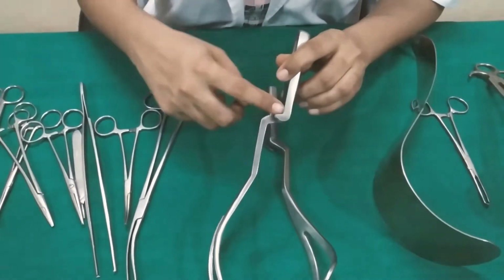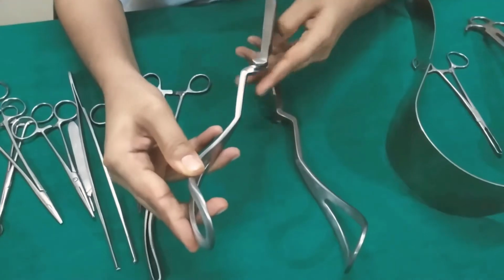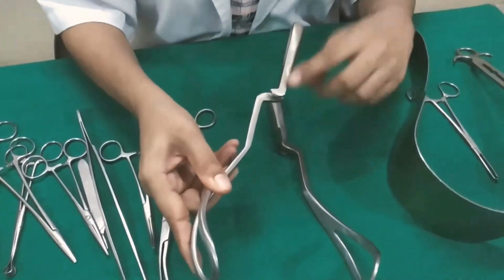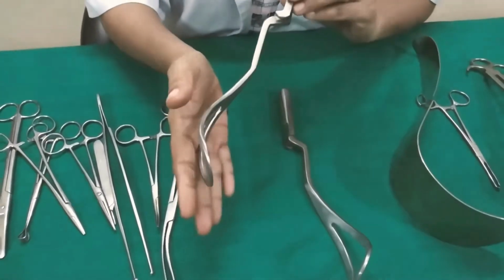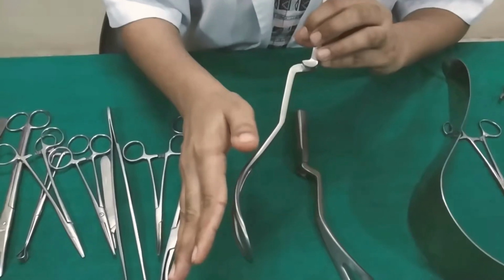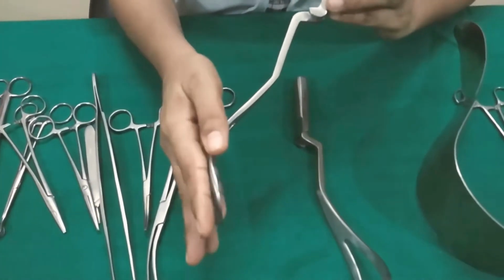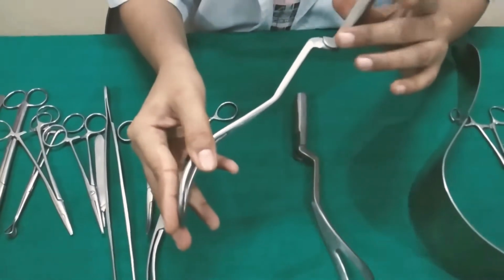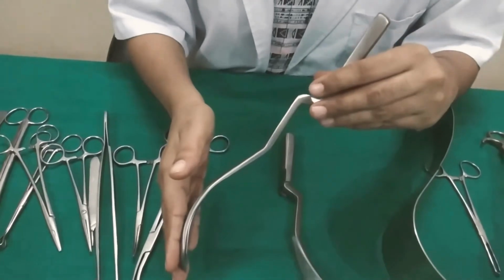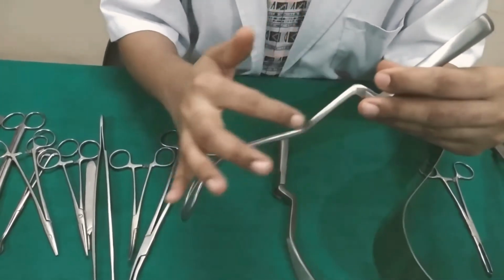So how? The left blade is held with the left hand, and the four fingers of the semi-supinated right hand are inserted along the left lateral vaginal wall. The left blade is held by the index, middle, and thumb in a pen-holding manner, held vertically parallel to the right inguinal ligament.